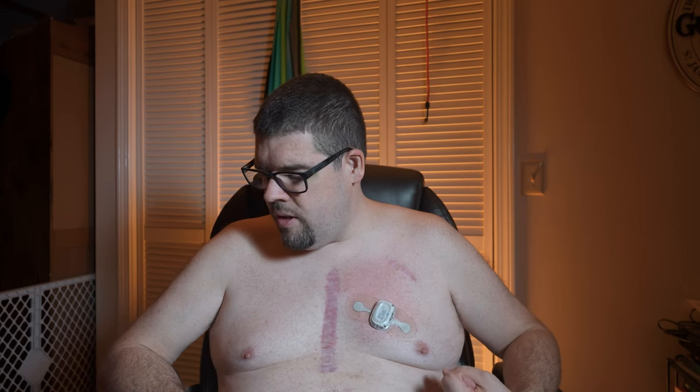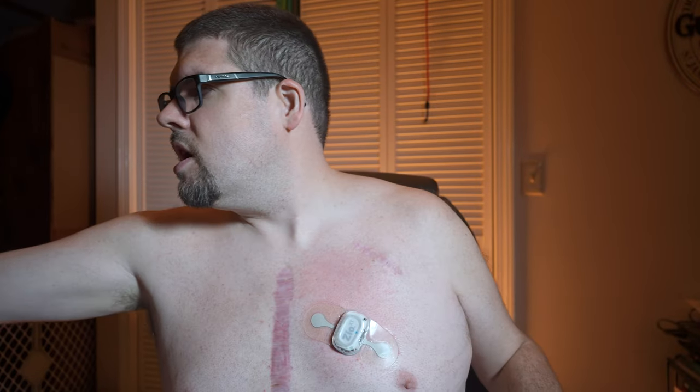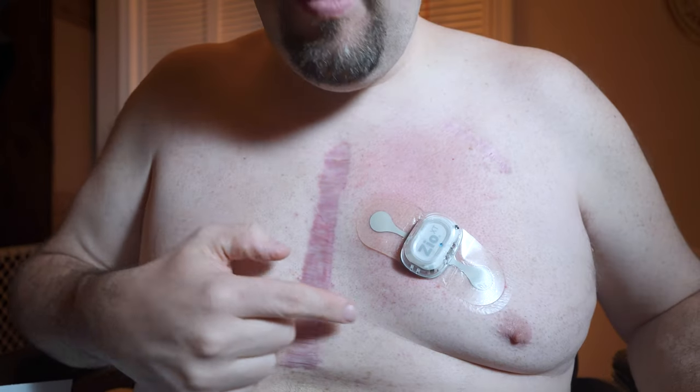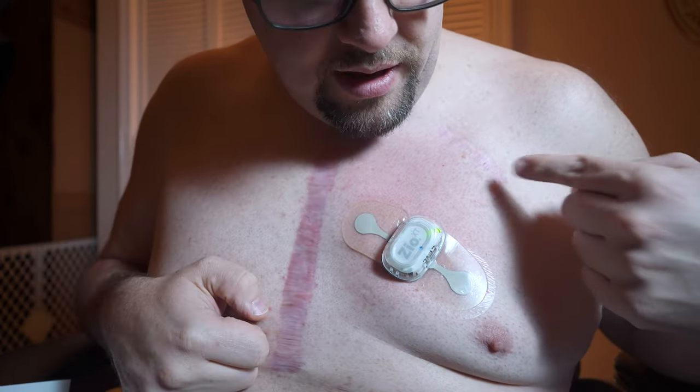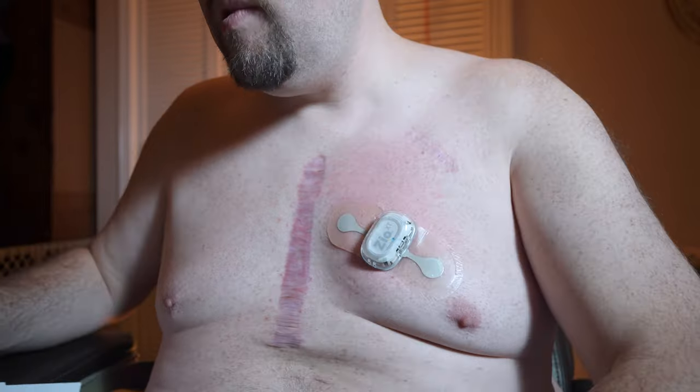Next step — the instructions say to turn it on. I'm going to push this button right here. It will flash green and begin recording your heartbeat. Let me come in nice and close here. One, two, three — there's a green light blinking. That's a good sign. So it's on. Perfect. My Zio patch is officially on.